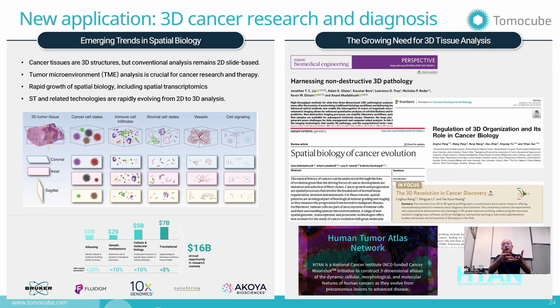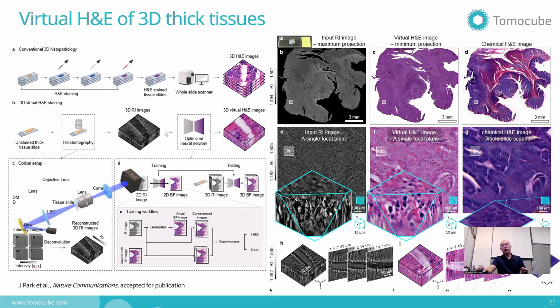And that's why many research groups are employing many different techniques such as micro CTs, light microscopy systems, and serial sectioning. Those are all technically important applications, but we wanted to use HCT and virtual staining. So to make a long story short, we prepared 6 samples: 50 micrometer tissue samples from various cancers. And then by applying AI, this is the virtual H&E data without serial sectioning, no staining.